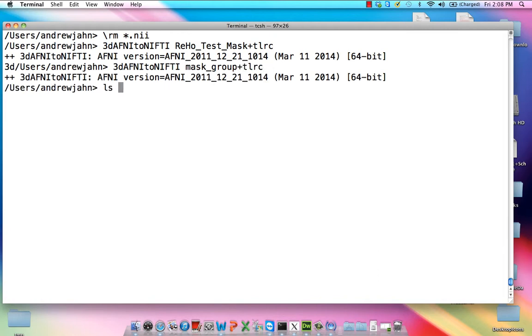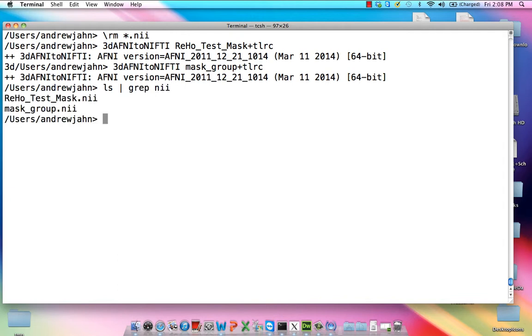Okay, so now both of those are in NIFTI format, and what I'm going to do is I'm going to now, as we did before, calculate the mean and the standard deviation across all of the voxels within that mask. So I'm going to call this one meanReho.